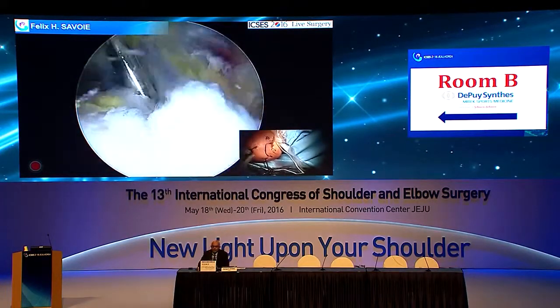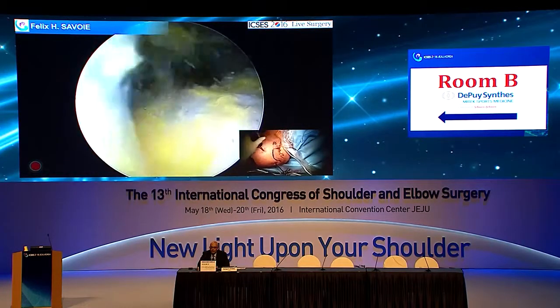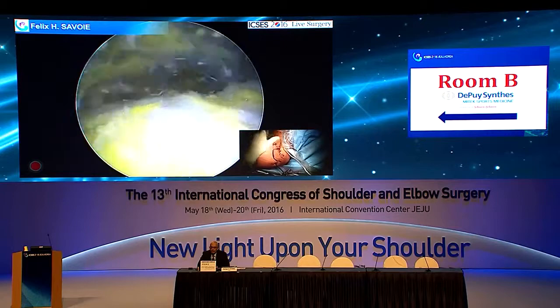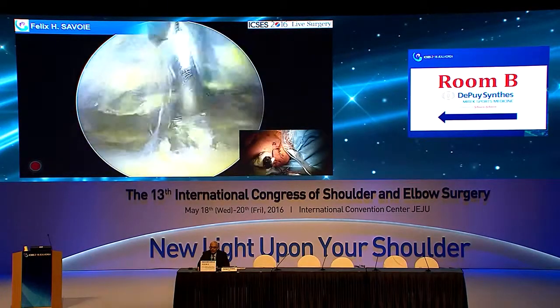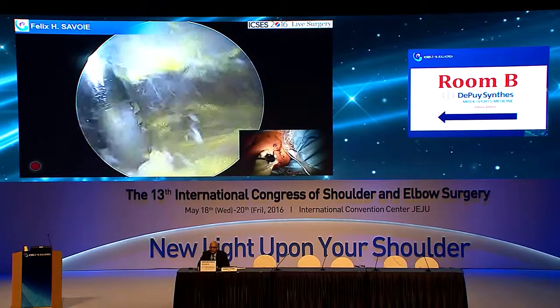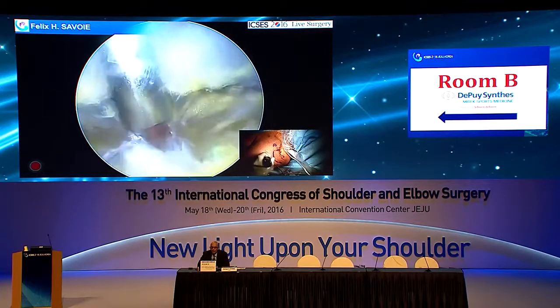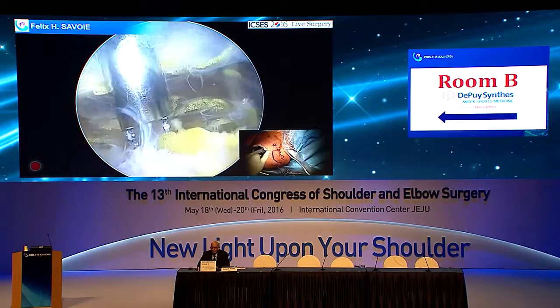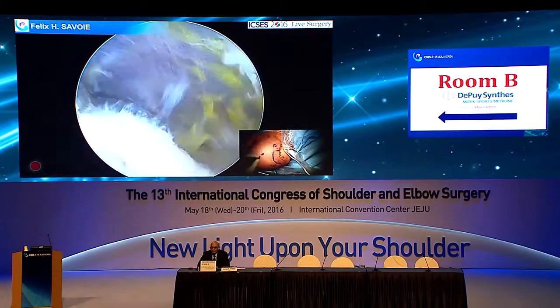And just make sure that it's pretty smooth, and it's not a problem here. We want to make sure we can get all the way down the shoulder. She had a minimal amount of bicep symptoms, so you can always come around here and take a look down the bicipital groove and see, as you see here, if there's anything more we want to do. Here's the groove. Really not much going on there. No real tendon, a little bit of a tendon, but not really any synovitis or anything we want to deal with. So we can leave that alone for now.